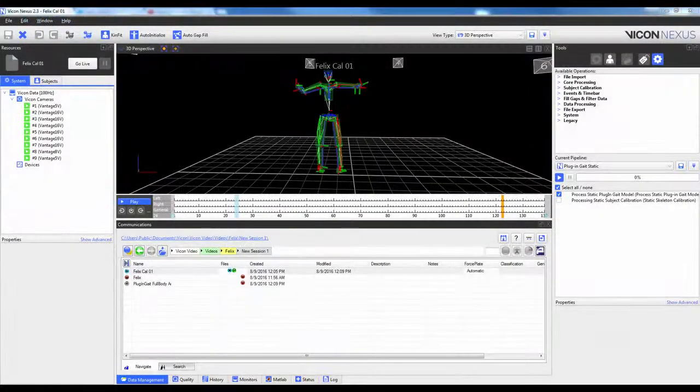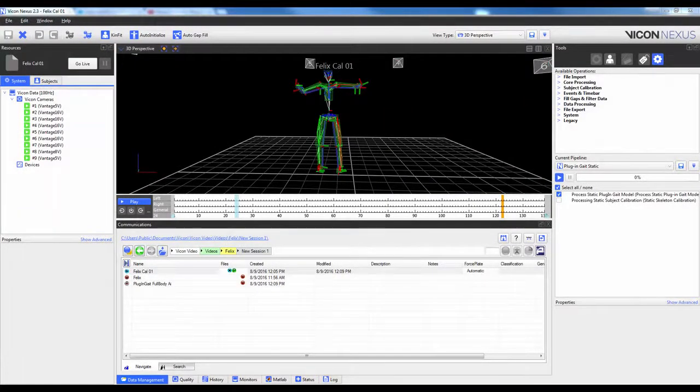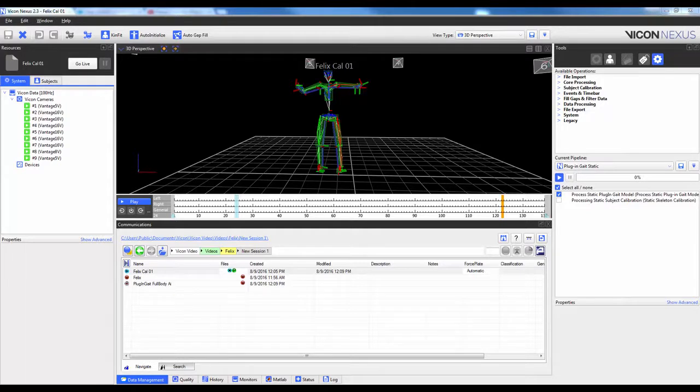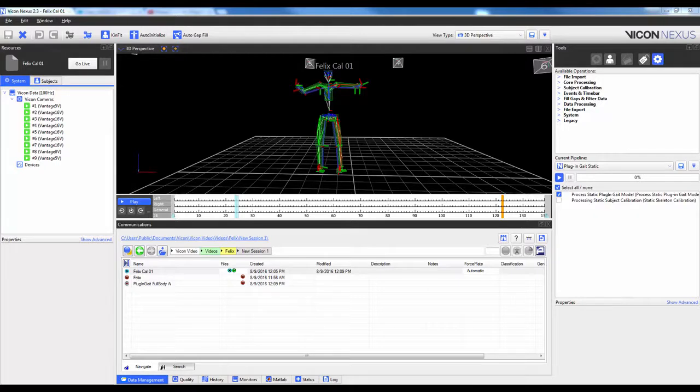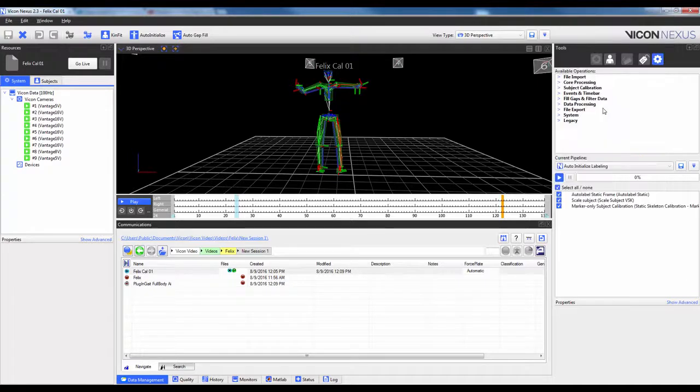If you are certain that you get a good motorbike pose every single time and you want to automate the processing of the static trial, you can do the following. We're going to go ahead and create a new pipeline which combines the Reconstruct, Auto-Initialize, and the Plug-in-Gait static pipelines.